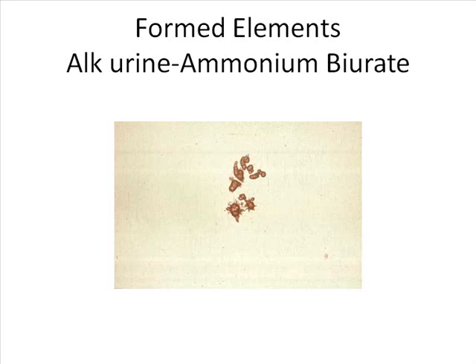This is really cool to see. Once again, it can be totally normal in urine, especially urine that is refrigerated. But when you see these, they are very distinct. They do look like a little apple that has little spicules on it. And if you look at the urinalysis book that we use, the graph book that we look at the pictures, on the outside of the book she has a thorny apple crystal, and it looks really distinct when you see it.